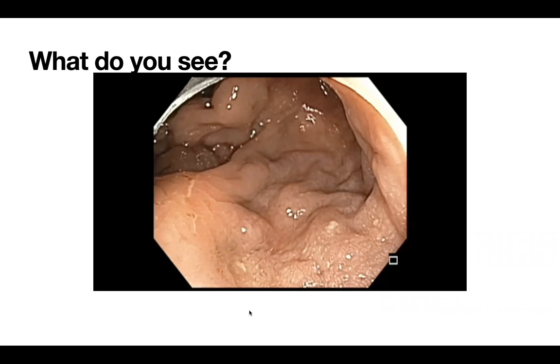And I debated, hey, should I just cut this cell component, which is small, and then finish the job, or should I be cutting all this abnormal looking mucosa, whether it is neoplastic or not? And that was my debate. And I did not do the retroflexion, to be honest with you.